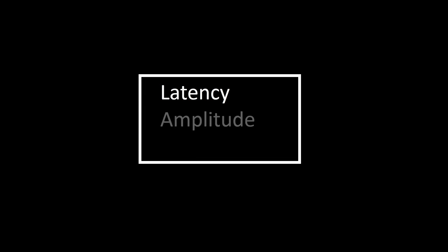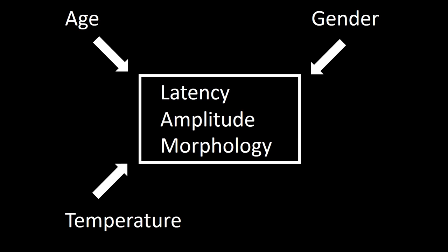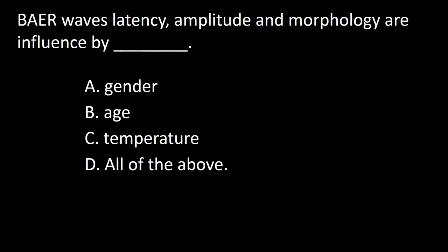Latency, amplitude, morphology are influenced by age, gender, temperature, and also by the click. So the answer to this question is D.